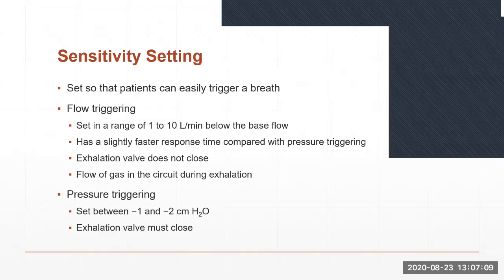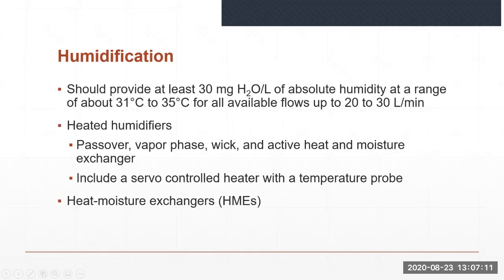In a spontaneously breathing individual, inspired air is typically conditioned down to the fourth or fifth generation, or subsegmental bronchi, which is the isothermic saturation boundary, or ISB. Under normal circumstances, conditioning of inspired air occurs as air passes through the nose and upper airway. Because these are bypassed during invasive ventilation, a humidity source must be added to the ventilator circuit.